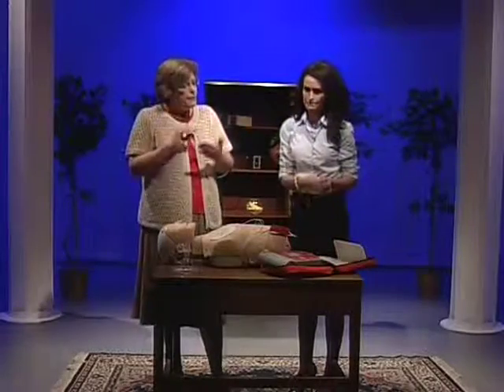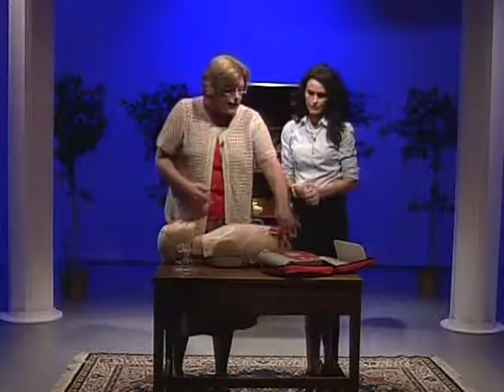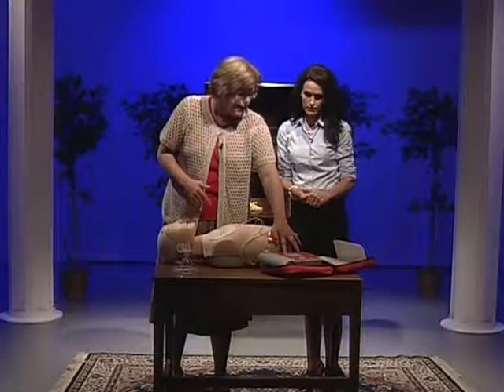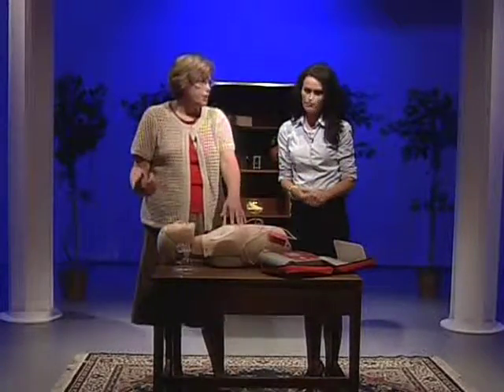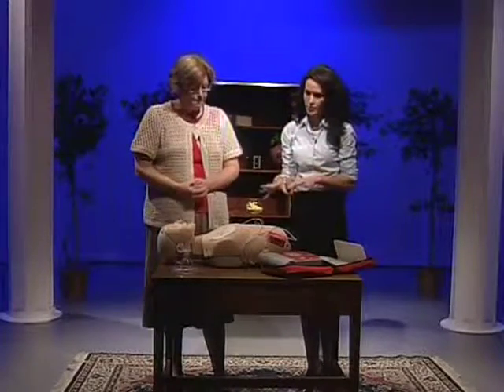That's correct. But typically, if someone collapses suddenly in front of you, it's not going to be a flat line. It's going to be fibrillation. Analyzing heart rhythm. Do not touch the patient. And you'll notice it's timed out 2 minutes, so that was telling us that it's time to come off the chest and let the machine analyze it again. You would have been doing compressions until then.